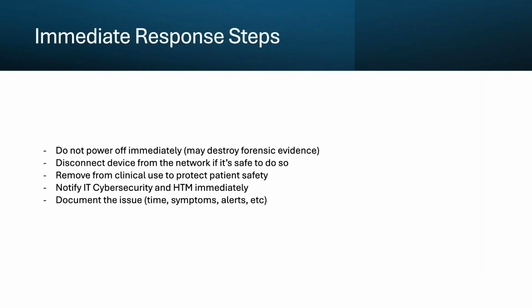Remove the device from clinical use immediately. Patient safety is our top priority. Find an alternative device to continue care if needed. Don't risk patient safety by continuing to use a potentially compromised device.